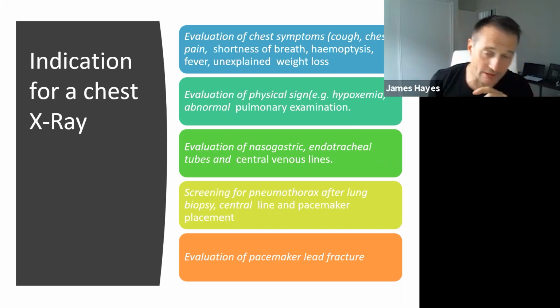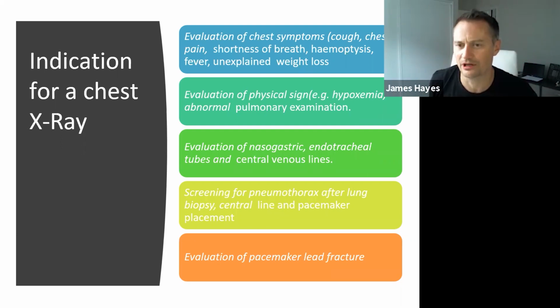So the only thing you can look for is the shape of the bone. You know roughly what shape the bone should be, and you're following where the outline is, but you can't see the cortical outline, the white bit, because it's the same shade as the plaster. So no, it's a godlike ability if you can, and no one can. Sorry. I can try and find out from some of my colleagues if there's any. Well, I'll add it to the list.